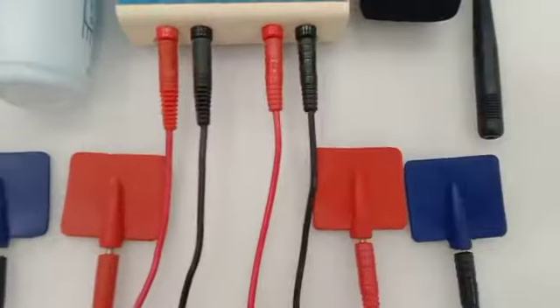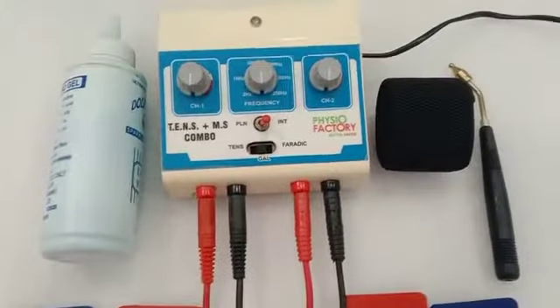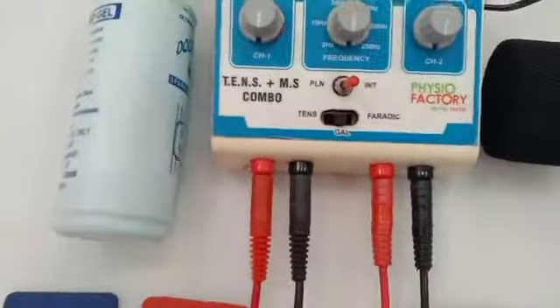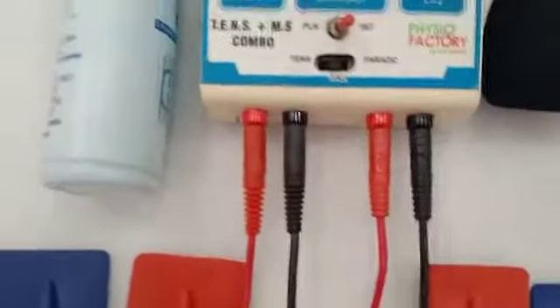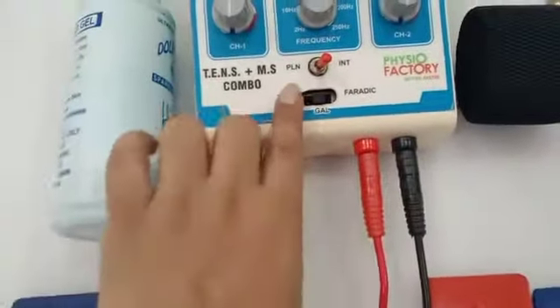I have attached all the wires and electrodes. Now you have to connect the wire to the main socket, and then you have to choose the frequency which you want to use.